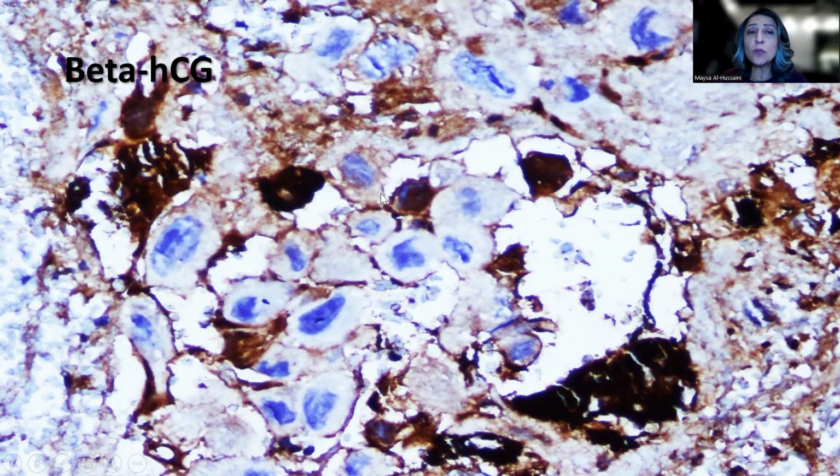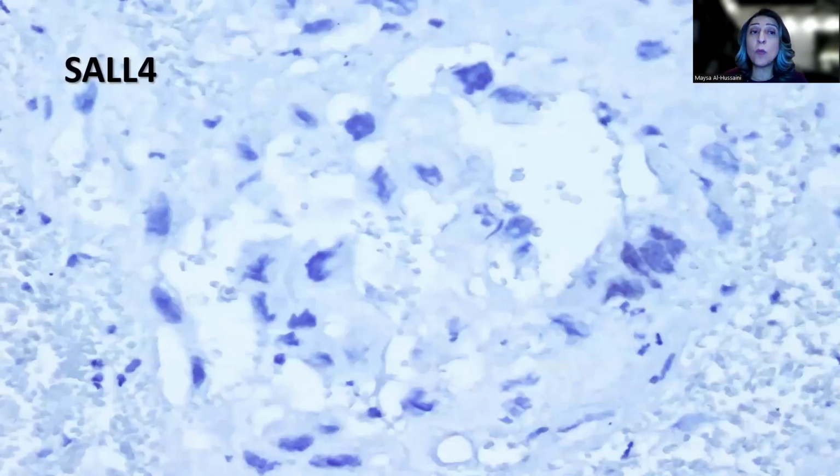Some of these tumor cells are positive, but I honestly find GATA3 a much more robust immunohistochemical stain to support, in the appropriate context, along with other clinical as well as immunohistochemical markers, a choriocarcinoma component. Remember that quite often SALL4 is negative in the choriocarcinoma, whether the cyto or the syncytiotrophoblasts.